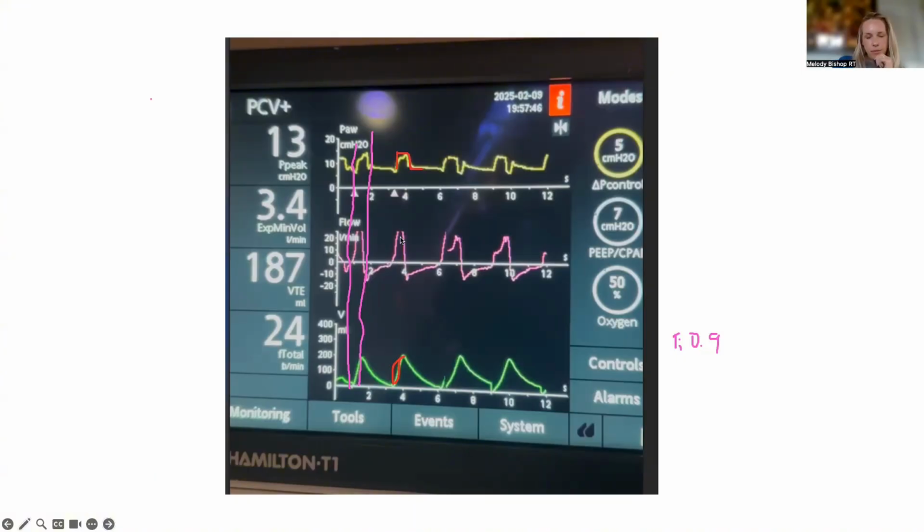Number two is on the flow. I can't see it here, so I guess it's higher than even the screen can show. It probably goes up to here, but then it's a straight line down, and you really wouldn't expect that. What you would expect is, for a passive patient, a natural decay down to baseline and then cycling off into expiration. So the flow pattern is all kinds of wonky out of the gate: weird pressure, weird flow. If we get into the dyssynchrony talk, there's probably a little bit of a delayed trigger, because it looks to me like the pressure starts to dip back here.